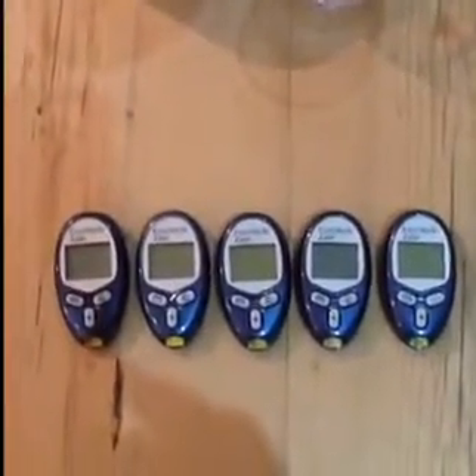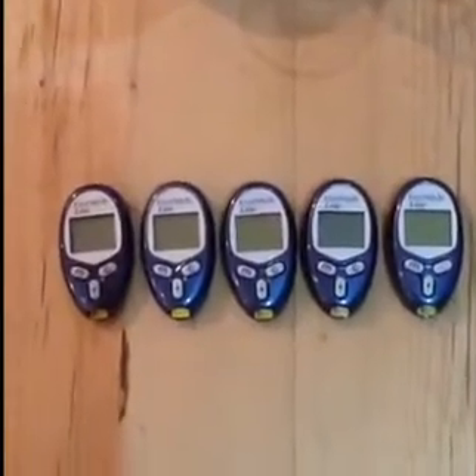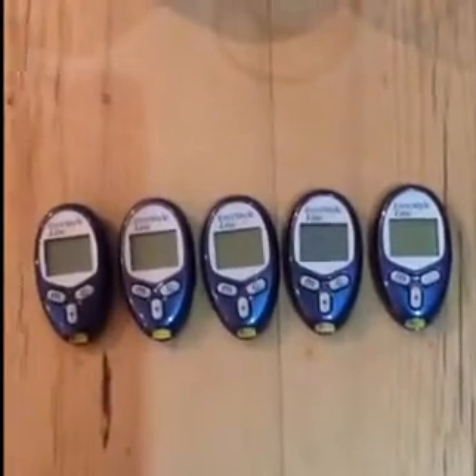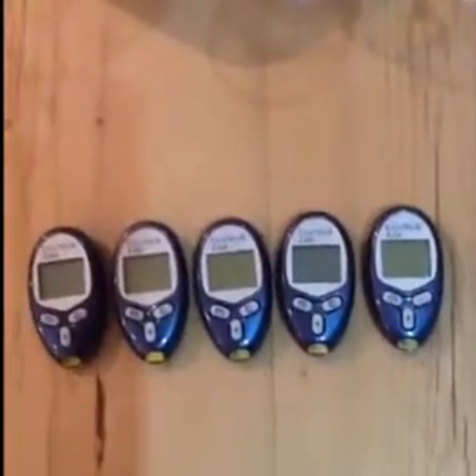Hi there, this is FarmerFudge. What I'm going to do here is purely an experiment about whether you can reuse a test strip for one of the blood glucose meters. It's just an experiment. I'm not saying it's right or wrong, I'm not saying people should do this or whether you can trust the results.